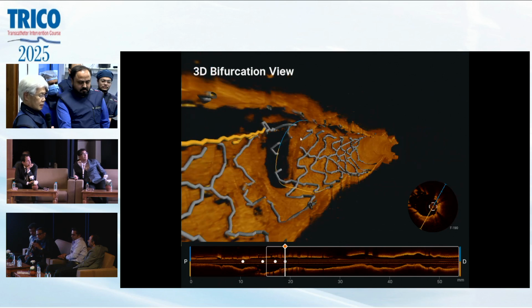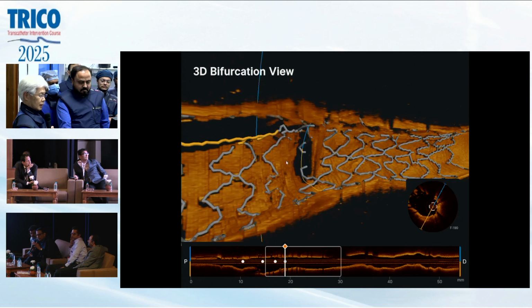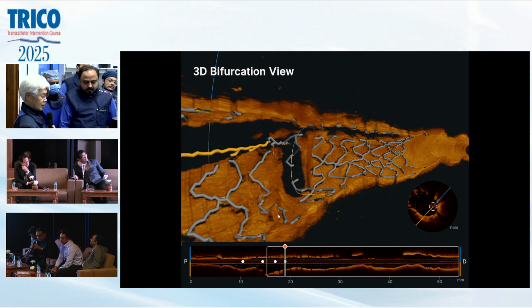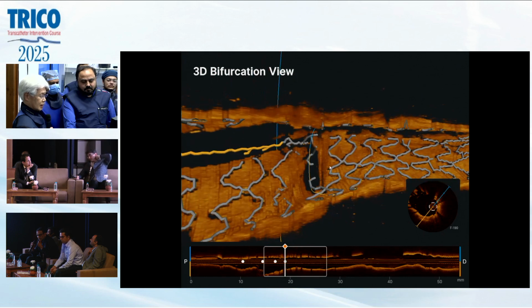Is it possible to say if it is a strut or a link on the 3D image? I can speculate, right? Here you have a link, right? That's right. So then might be the link here and here, right? And this might be the link here. So link should be around here, I'm afraid. So we can say that it looks mostly like a strut except for half of one link that's across the mouth of the diagonal. Is that okay? Yeah.